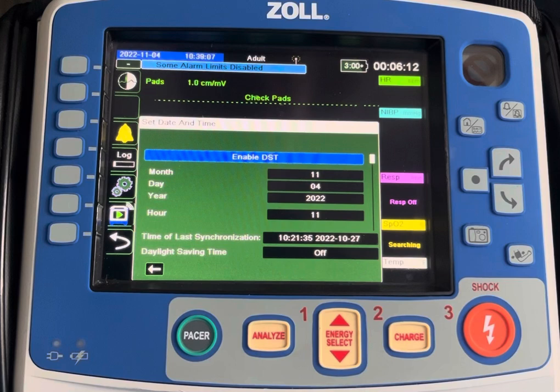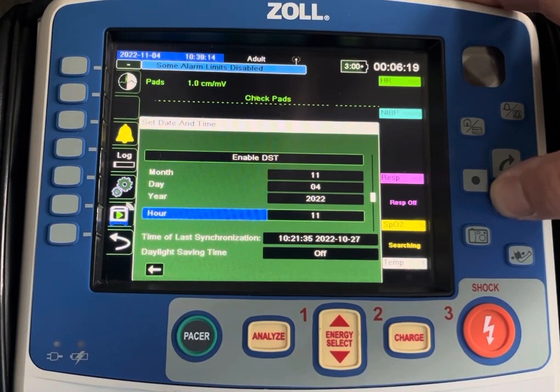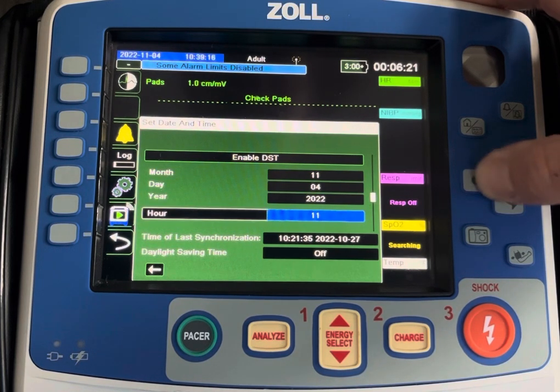It will then read Enable, which we will enable when we change the time in the spring. But for now, we just disabled it. Then we're going to go down and make our hour adjustment. In this case, we're going to fall back an hour.